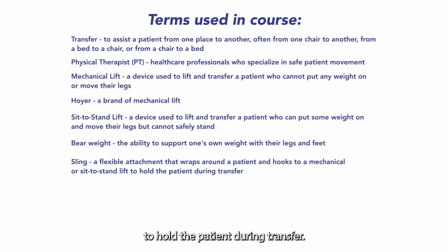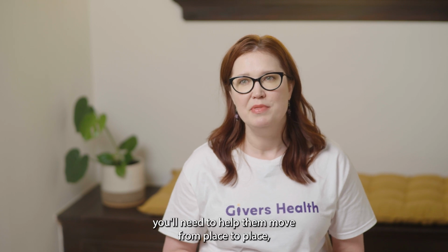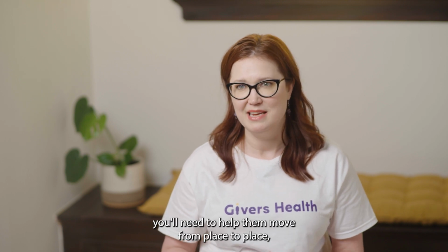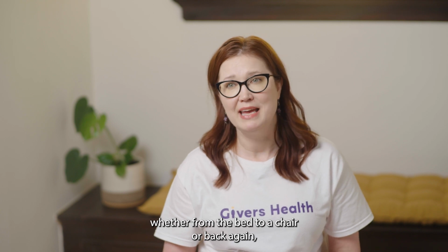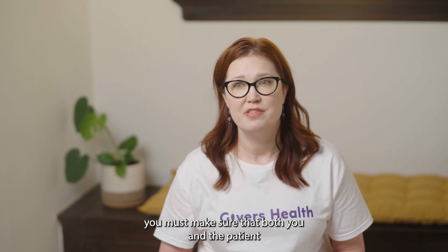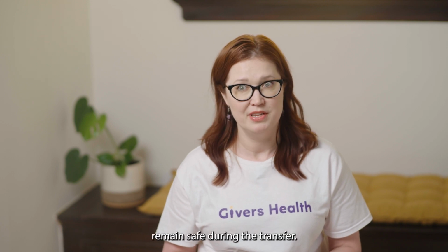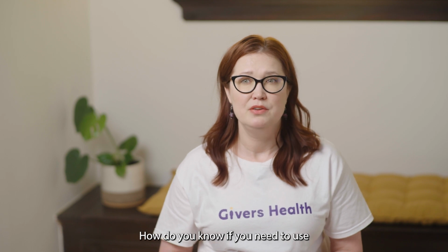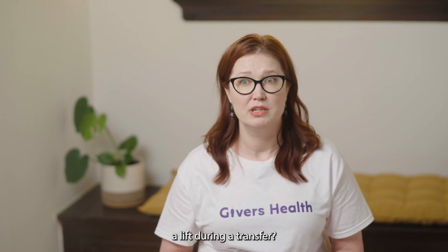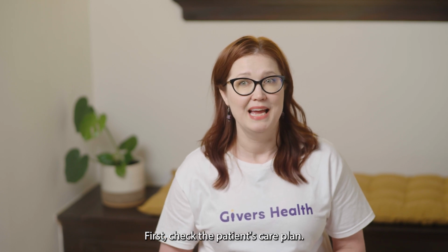patient during transfer. When caring for your patient, you'll need to help them move from place to place. Whether from the bed to a chair or back again, you must make sure that both you and the patient remain safe during the transfer. How do you know if you need to use a lift during a transfer? First, check the patient's care plan.